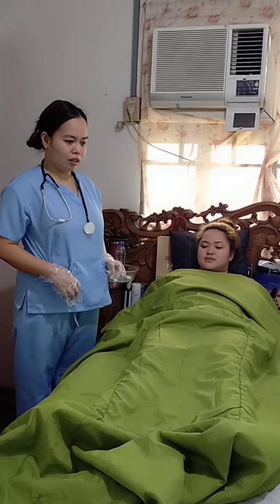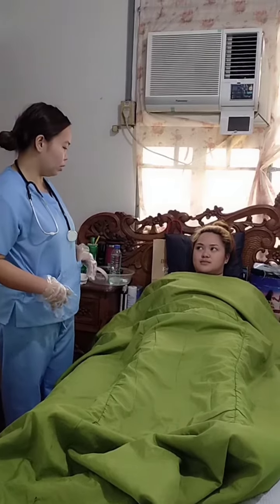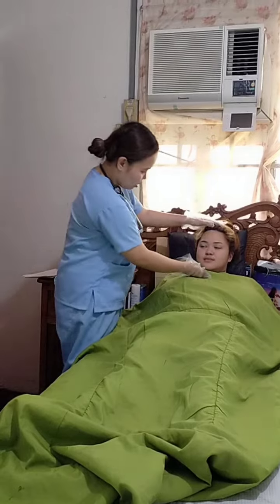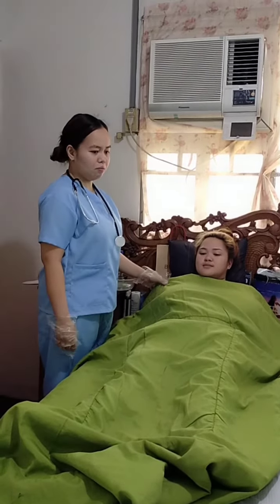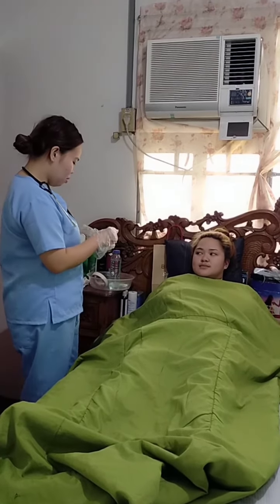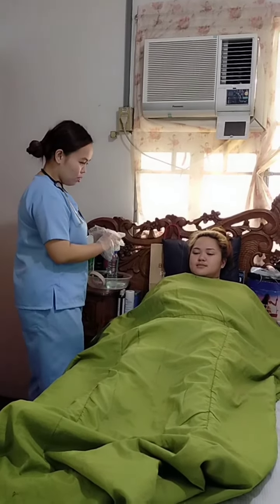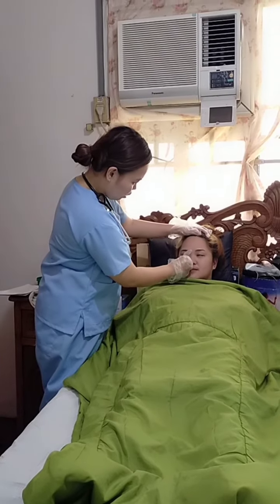Ma'am, inhale and exhale, and then we're going to clean your nose using the cotton balls.